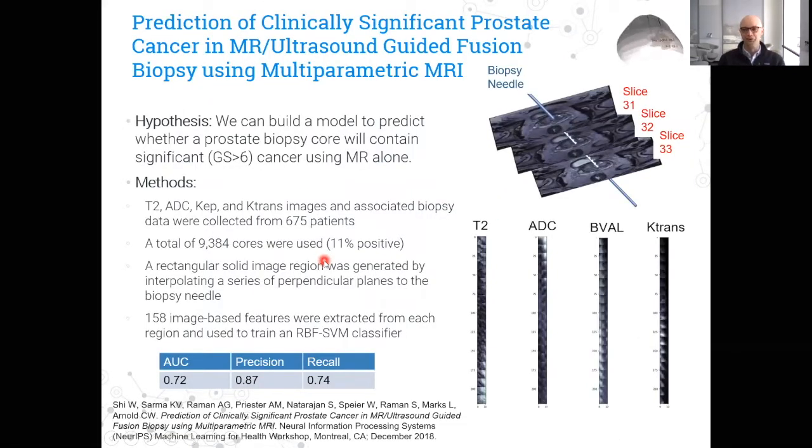At UCLA, we do a lot of ultrasound fusion targeted prostate biopsies. This procedure generates an interesting data set that I've attempted to show on the top right here, where you see the contour of a prostate rotating. Within the prostate, you see several additional contours. These were drawn by the radiologist and delineate areas that are suspicious for cancer. These ROIs are used during the biopsy procedure in that the images are fused in real time with ultrasound. You can see the lines through the prostate. These represent biopsy cores that were actually taken from the prostate.